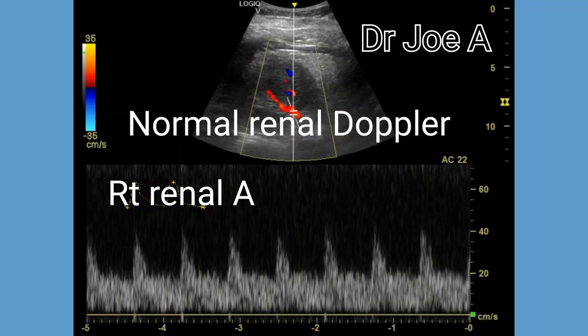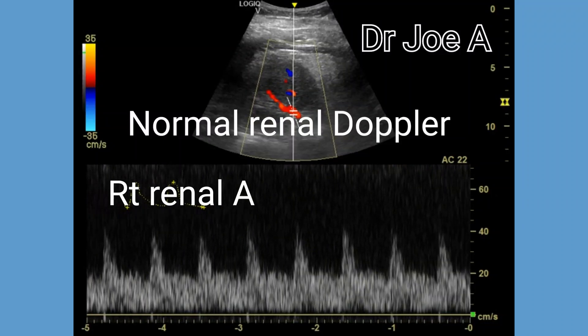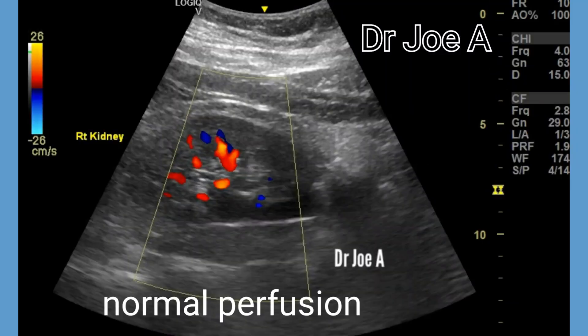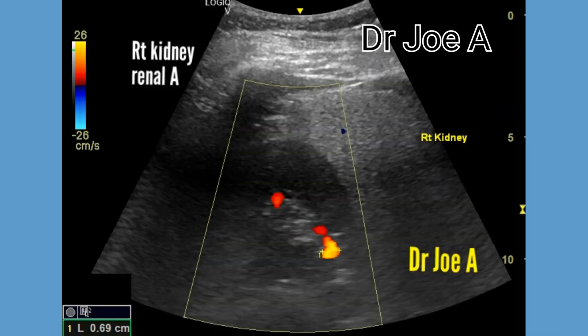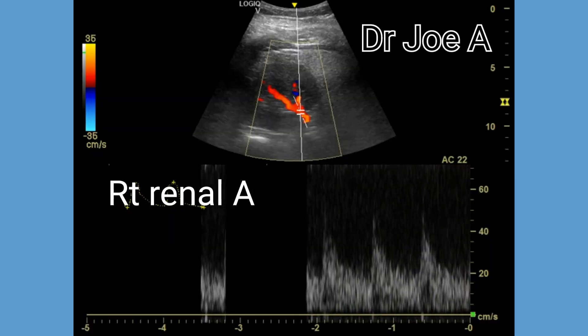This is a normal renal Doppler study. Both kidneys show normal perfusion on color Doppler ultrasound, with normal arterial flow seen up to the peripheral one-third of the kidney. The renal artery has a normal diameter of seven millimeters.